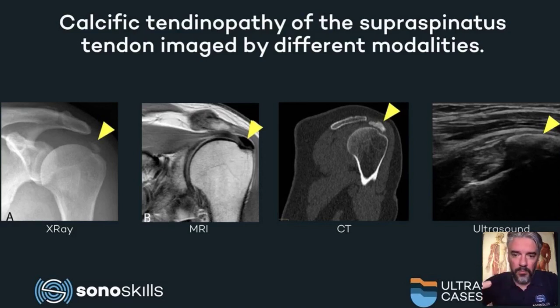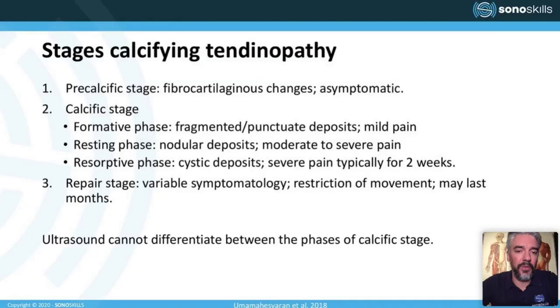And we know that we can measure calcification with a lot of imaging modalities, but ultrasound scores a 3 in the ESSR consensus statement. It has many patient advantages, being more patient friendly. It's dynamic, it's real time. It can visualize the calcification perfectly, especially if we have a type 1 or 2 calcification. Talk about that in a minute. So please use as much ultrasound as you can to look at calcifications.